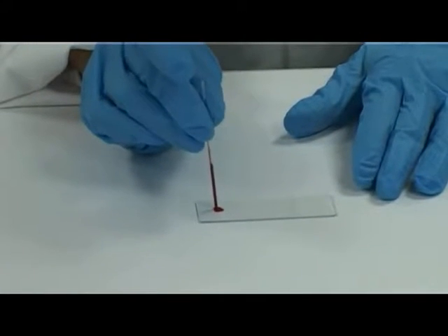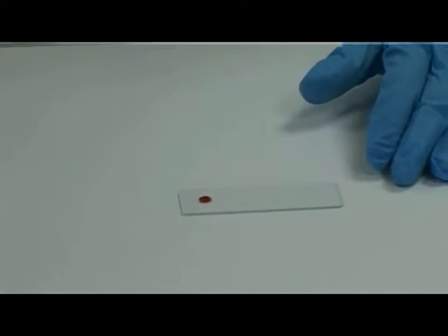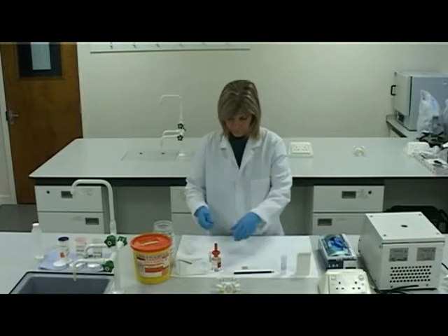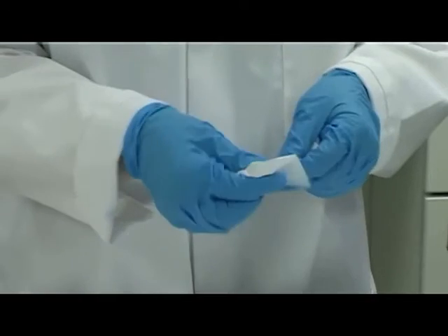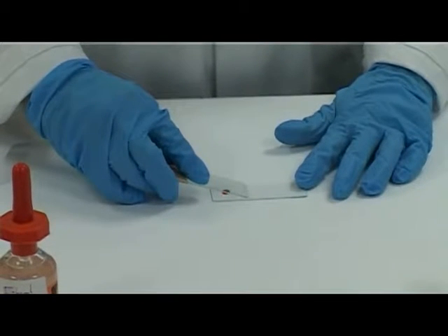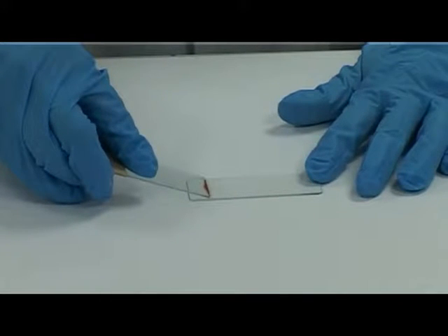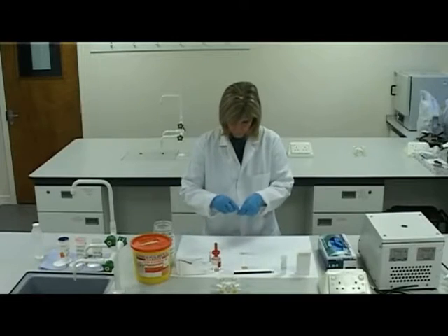If you are right-handed, place the blood dot on the right of the slide. Discard the capillary tube into the clinical glass waste bin. Select a spreader slide and clean and dry the spreader surface. Hold the blood sample slide firmly on the work surface. Place the spreader slide in front of the drop of blood, draw the spreader back onto the drop and allow the blood to spread along the edge of the spreader. Push the spreader forward across the slide in a single smooth motion.